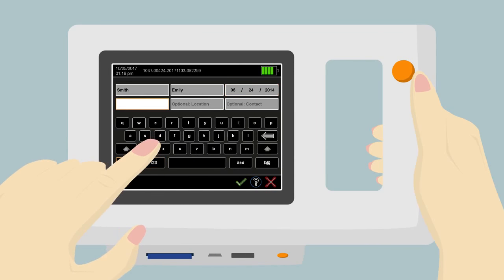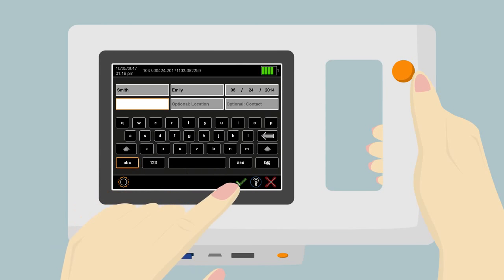In the plusoptiX S12R model, a single line to enter individual patient data will be displayed. This data cannot be saved to the patient database, but will be shown on all printouts for this measurement. Touch the green check mark in the navigation bar to confirm your entry.